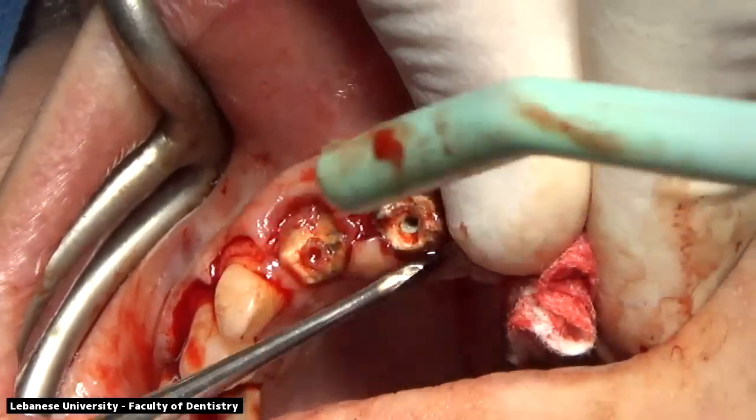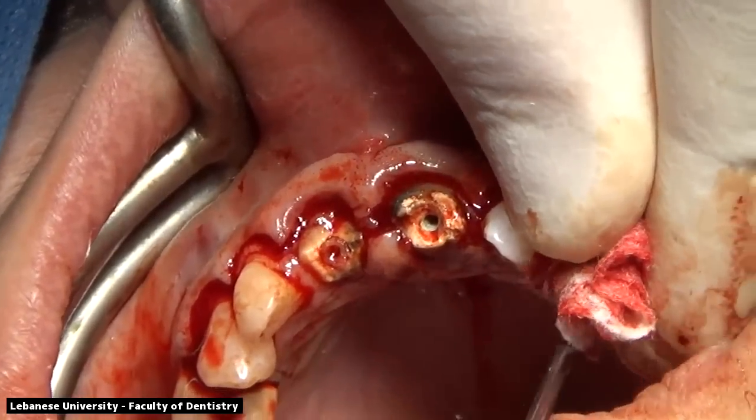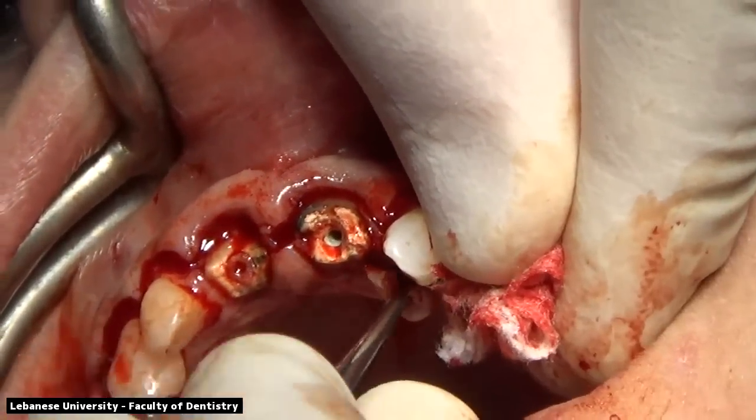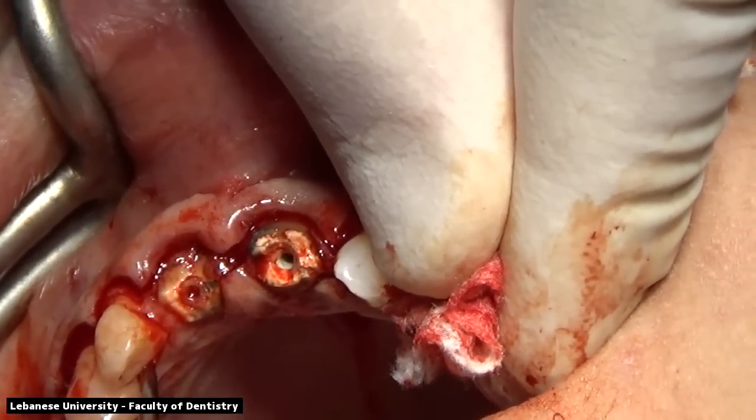We can appreciate from this image that we have badly decayed central incisors. We do not have any crown left on these central incisors, no ferrule effect, and no possibility for restoration of those two central incisors.